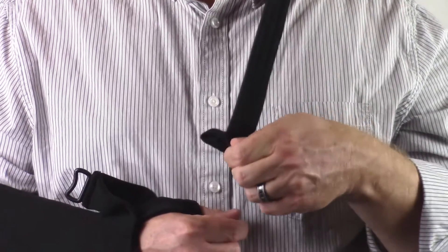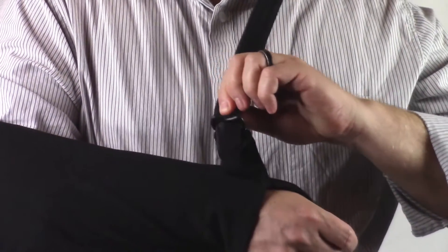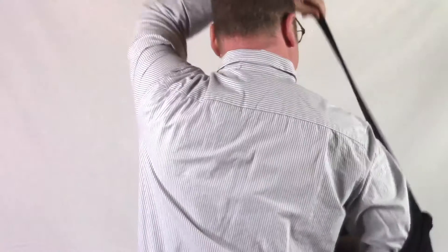Finally, release the hook and loop tab from the strap and insert into a plastic loop at the top of the pouch. The hook and loop tab adheres to any place on the strap as it wraps around your back.